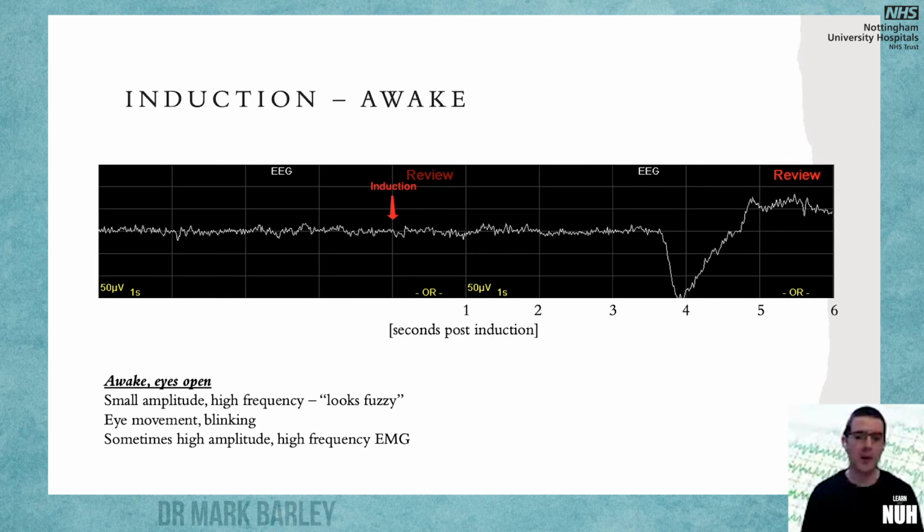Intubation is a maximal stimulus. It's in fact a greater stimulus than surgical incision. And it's a time of huge cortical arousal, as I'll show you later on. So I really think we want to have the brain monitored prior to the induction of anaesthesia. And the patients seem to tolerate it well. And they all seem to say, well, you won't find anything in there, doc, which I'm sure the radiologists and radiographers get with every CT brain they ever perform.